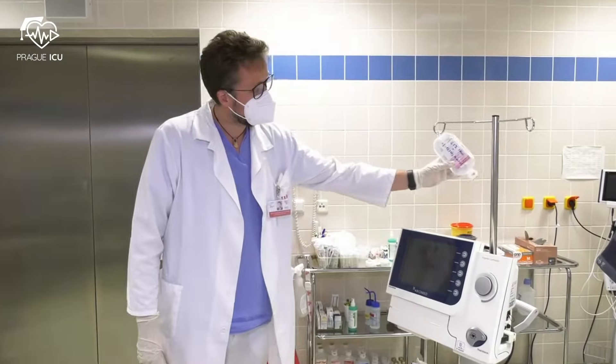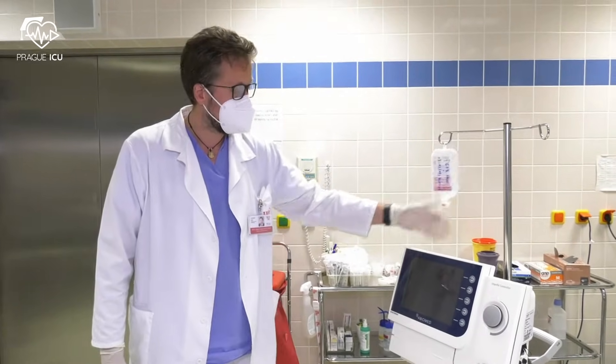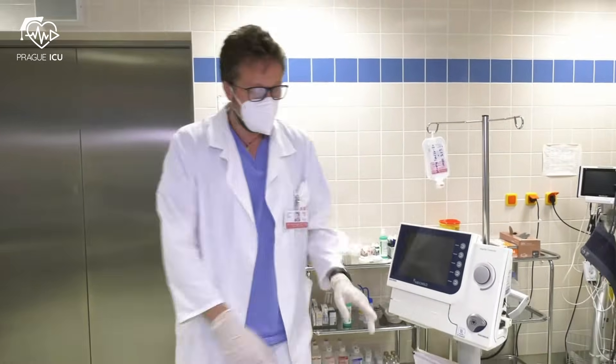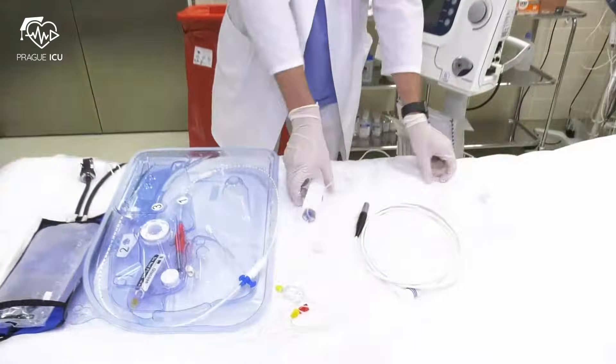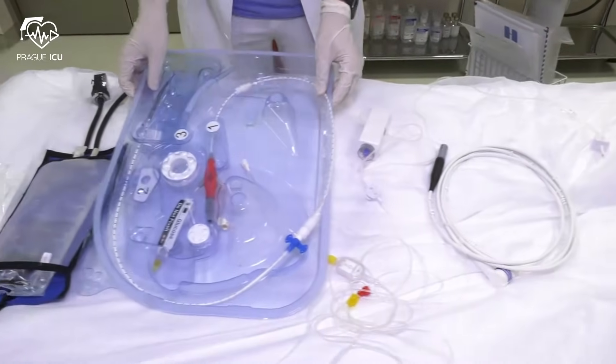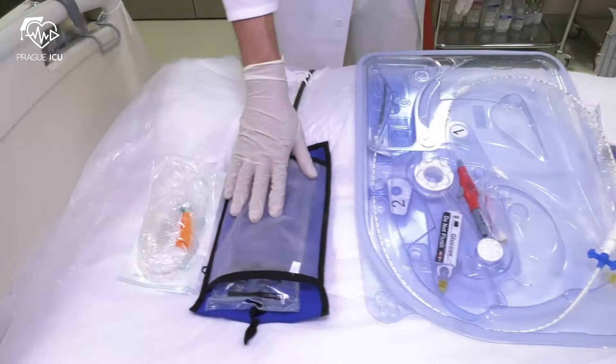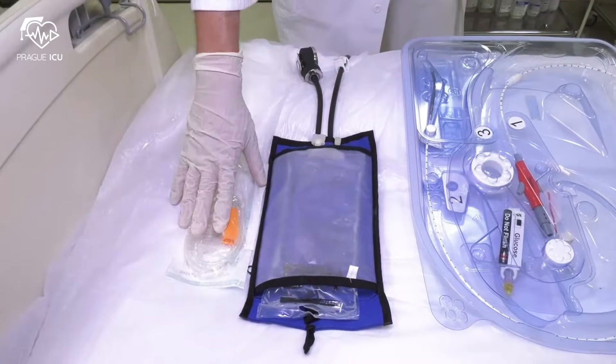First, we have already prepared glucose 5% with 25 units per milliliter heparin for purge. Then we have the Impella controller, connector cable, purge cassette and Impella catheter in the container, sodium chloride and pressure bag, and finally straight tubing.